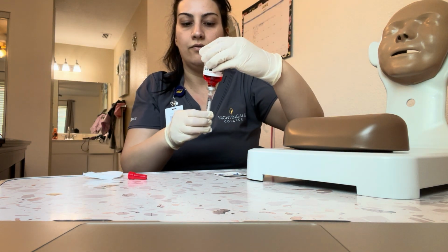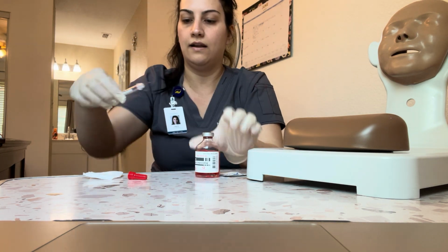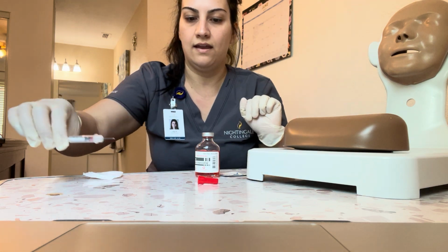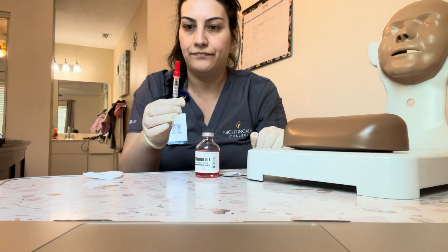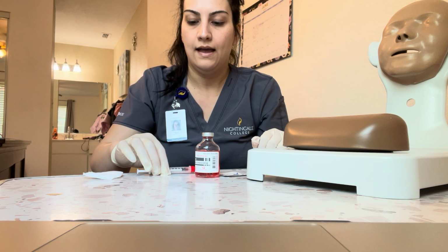And next we're going to take that out, and we're going to use the scoop method to close that. Okay, medication is ready to go.